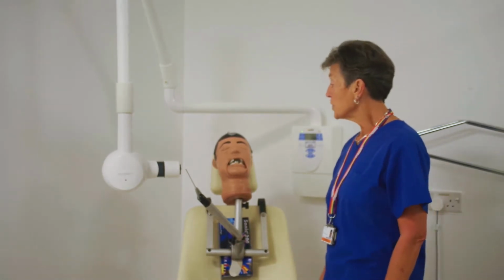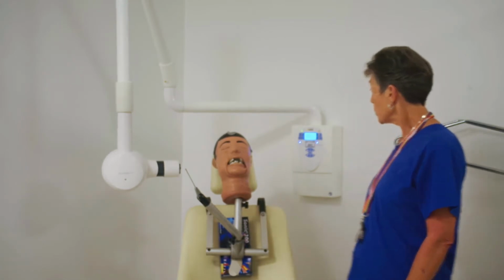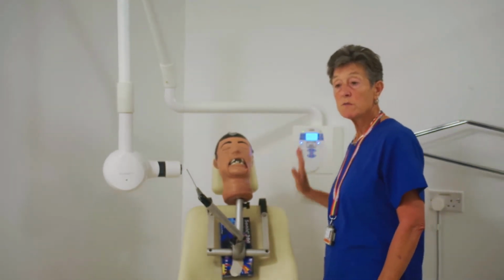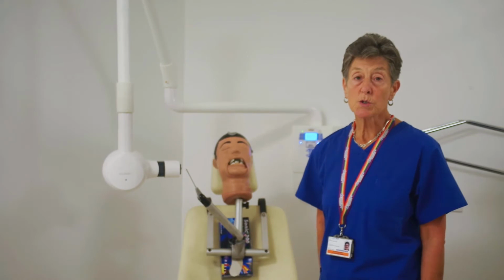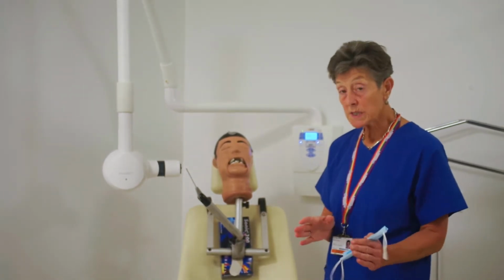The other ways that you can reduce the dose of the patient is by making sure that you use 70 kV. We use 70 kV because it reduces the skin dose by a considerable amount compared to 60 kV.